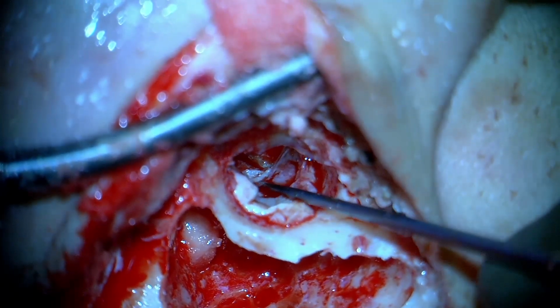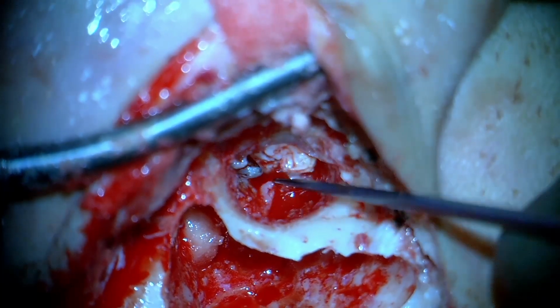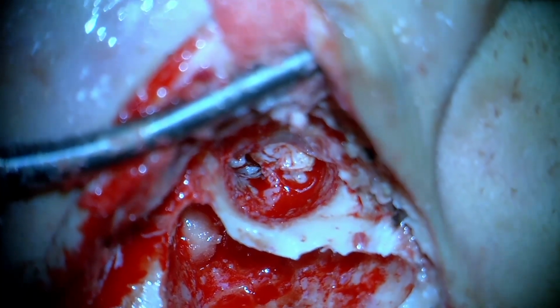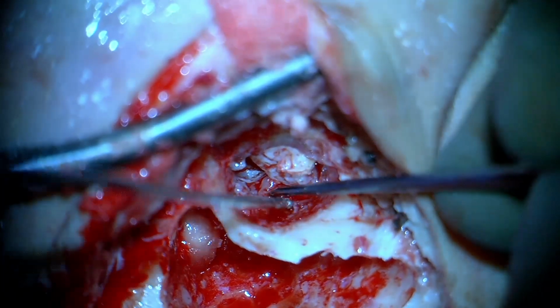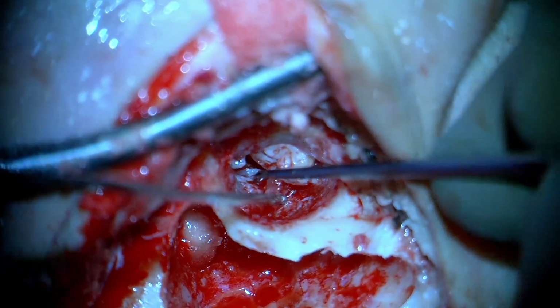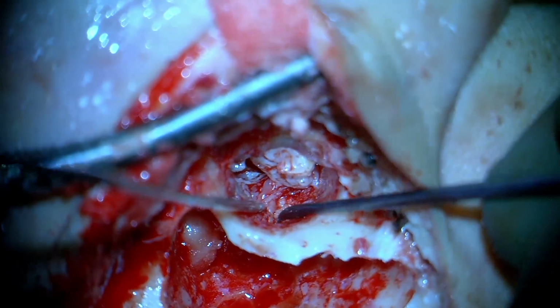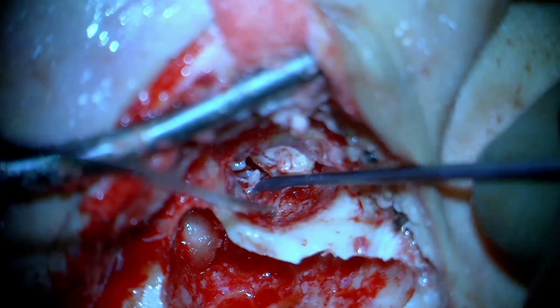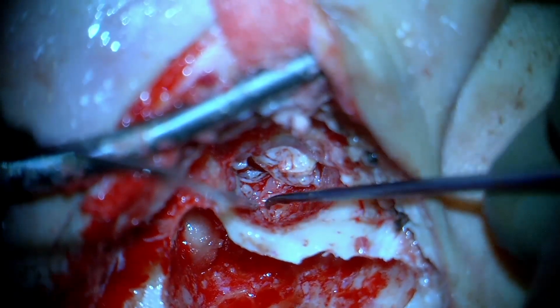Now see, once we put the tympanomeatal flap back just to assess approximately where we are, we're seeing a lot of granulations that are there contiguous with the canal defect that you see here. These granulations are continuous with the canal wall defect. They have to be removed, and some of them may also be inside the middle ear in the posterior superior region, I mean the posterior superior mesotympanum, which also have to be removed.